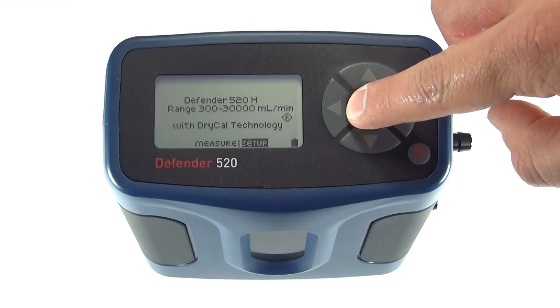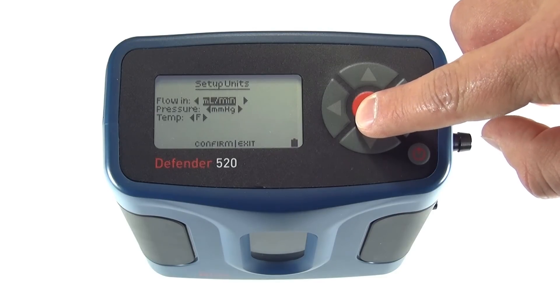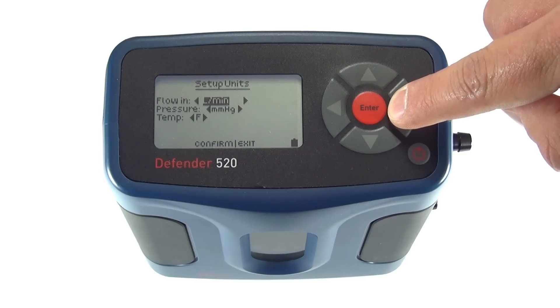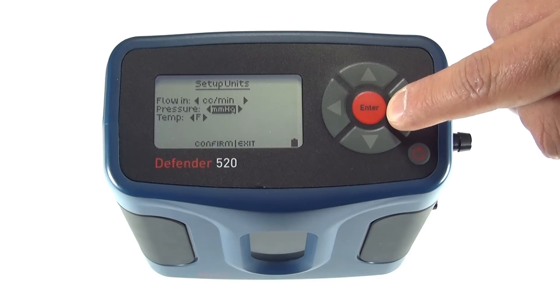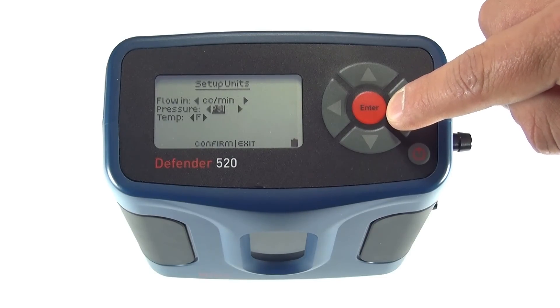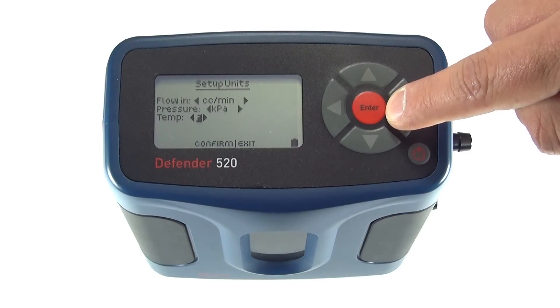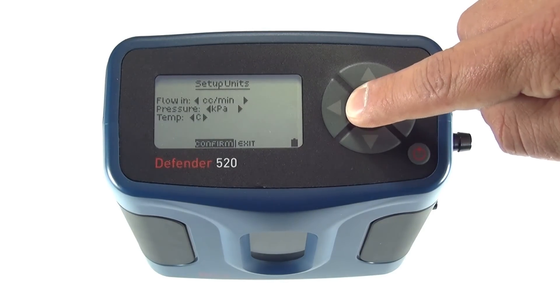By selecting Units from the Setup menu, you can choose from a variety of flow measurement options such as milliliters per minute, liters per minute, cubic feet per minute, or cubic centimeters per minute. Also quickly change the pressure settings to millimeters of mercury, pounds per square inch, or kilopascals. The temperature settings can also be changed to Fahrenheit or Celsius. Select Confirm to save your settings.